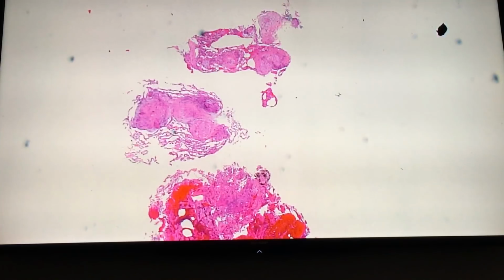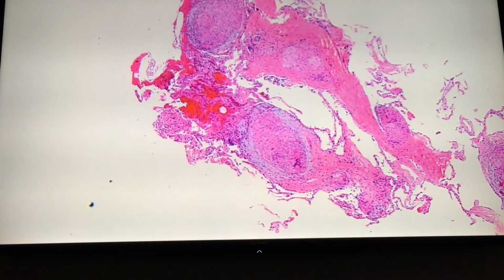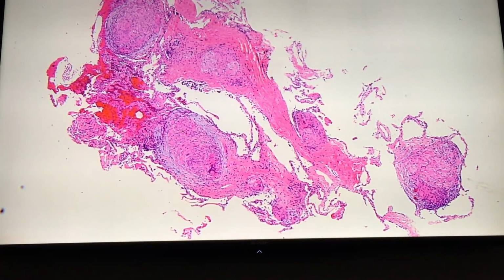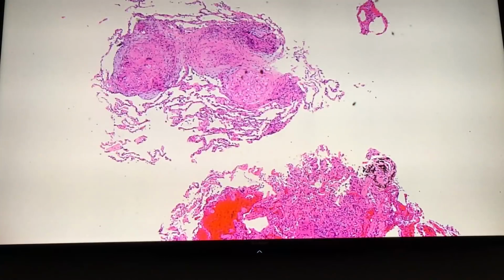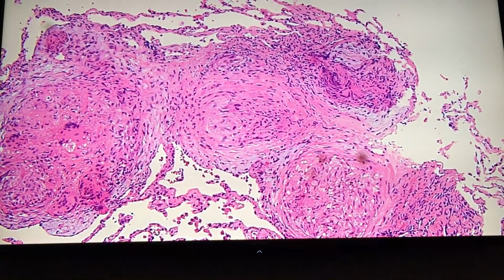All right, Aaron, all yours to show the lesion. What kind of specimen, guys? Anyone? What kind of biopsy? Transbronchial. Very good. Because it has alveolated lung, right? It's kind of roundish. It's not needle shaped, and so you're in a transbronchial biopsy. Non-necrotizing.